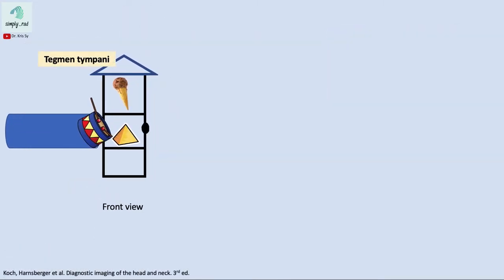Let's now focus on the middle ear. The middle ear can be likened to a three-story building where each floor has a prominent resident, except the first floor. Looking at the topmost floor, it has a roof called the tegmen tympani. This roof is the border between the middle ear and the meninges and brain above, so it is important and should be intact.